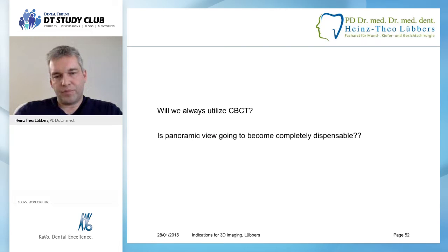Question for the future. Will we always utilize CBCT? So is the panoramic view going to become completely dispensable?